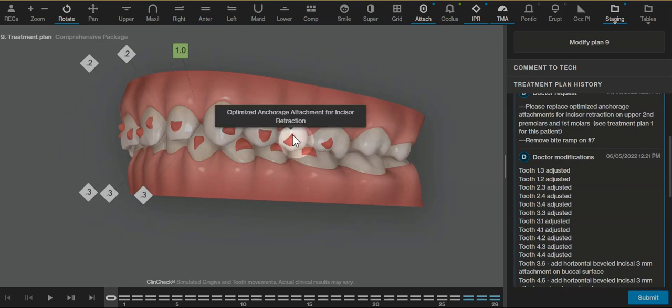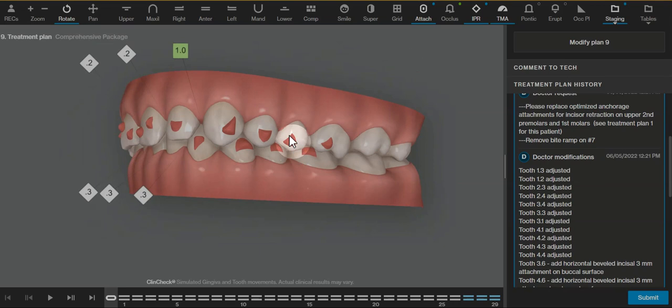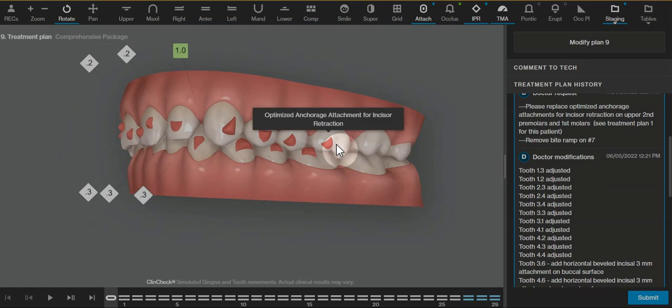And these are attachments that are not meant to do any direct pushing but have something in the SmartTrack of the aligner to keep the mesial aspects of these teeth back.